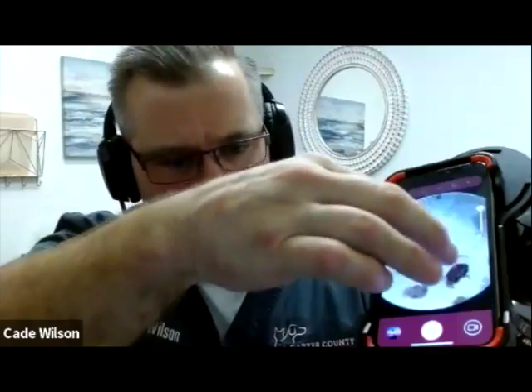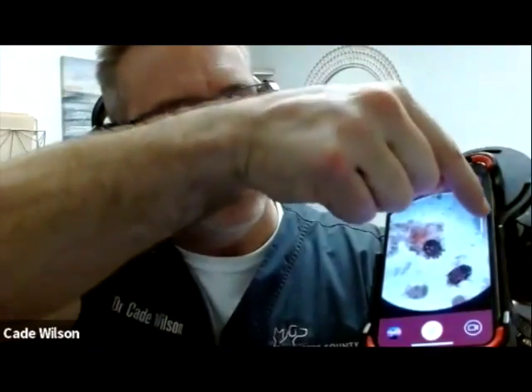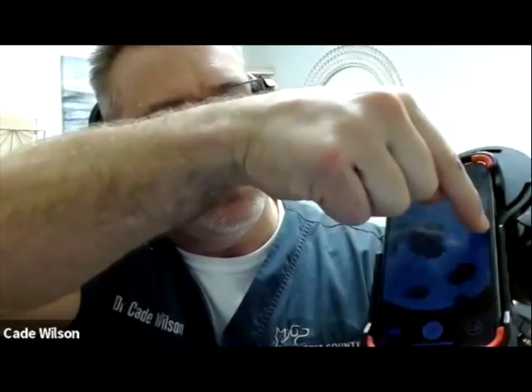And so I think we should go over that in a second too. But the app does help take better pictures, and it's got a tab on the side to toggle my lighting as well. I can toggle my light on the screen, not just my lighting down low. I can find my stuff here. I can adjust my light here, but I can also adjust it on the screen.